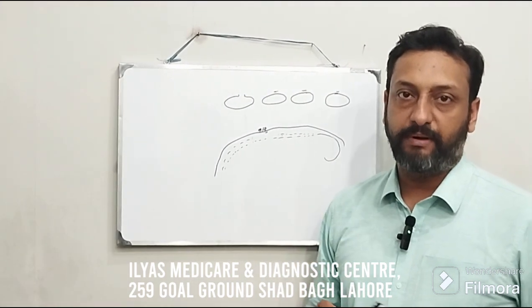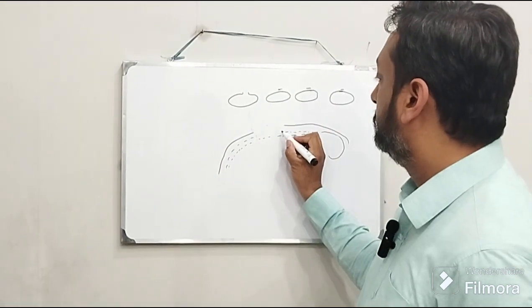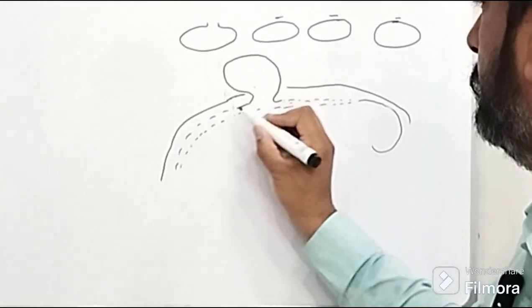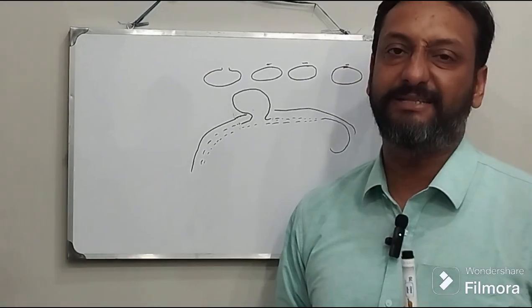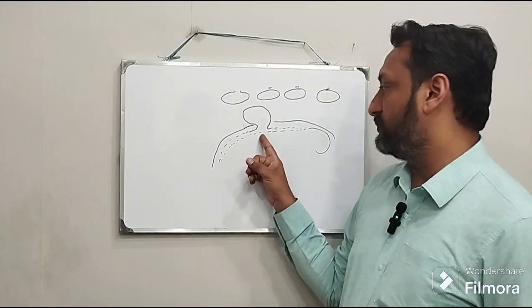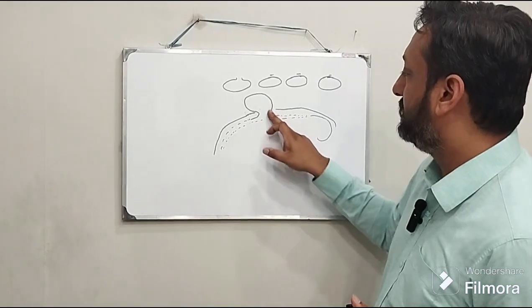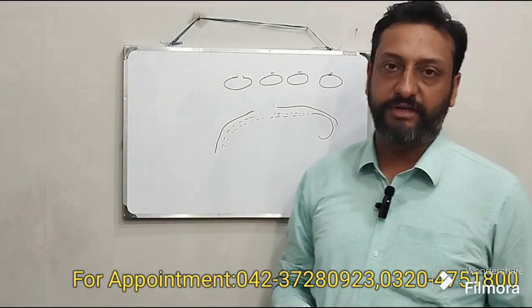Now the other variety is spina bifida aperta. In this is the spina bifida cystica. Spina bifida cystica is the thing where the spinal contents are bulging outside this posterior osseous defect in the form of a cyst. It can be a meningocele where only meninges are bulging, or a meningomyelocele where both meninges and the spinal cord are bulging. So it is easy to diagnose spina bifida aperta, but the spina bifida occulta is really difficult to diagnose, and the only sign is the disruption of this double tram track which represents the posterior osseous elements.